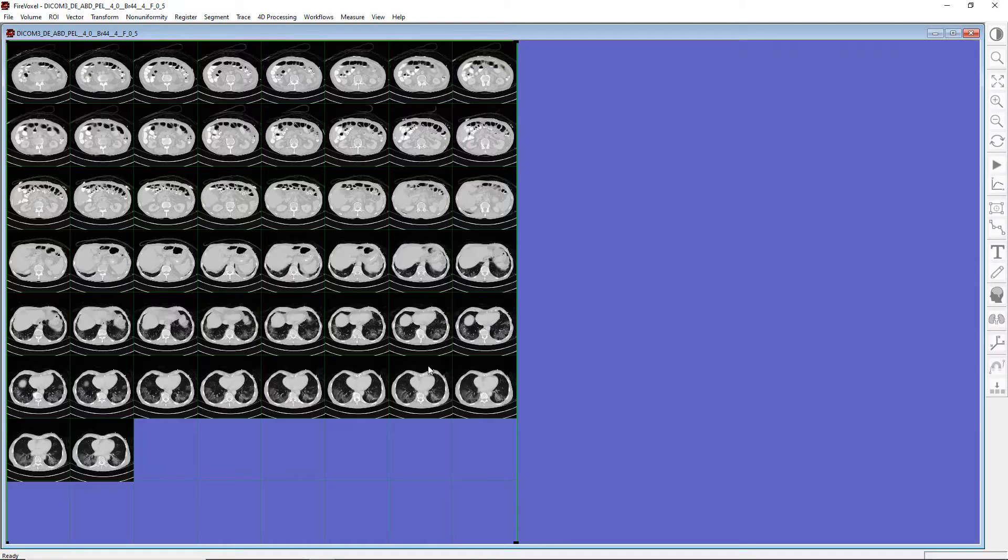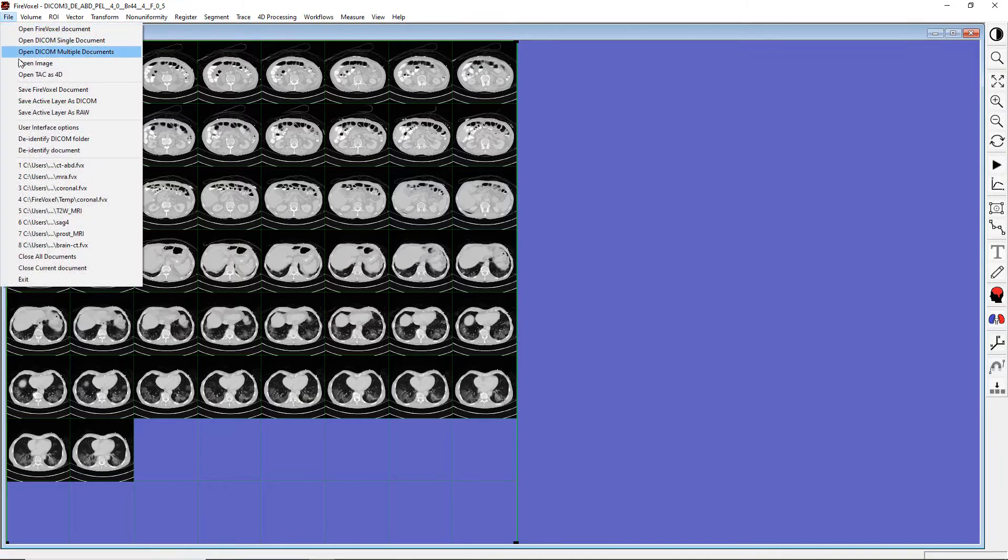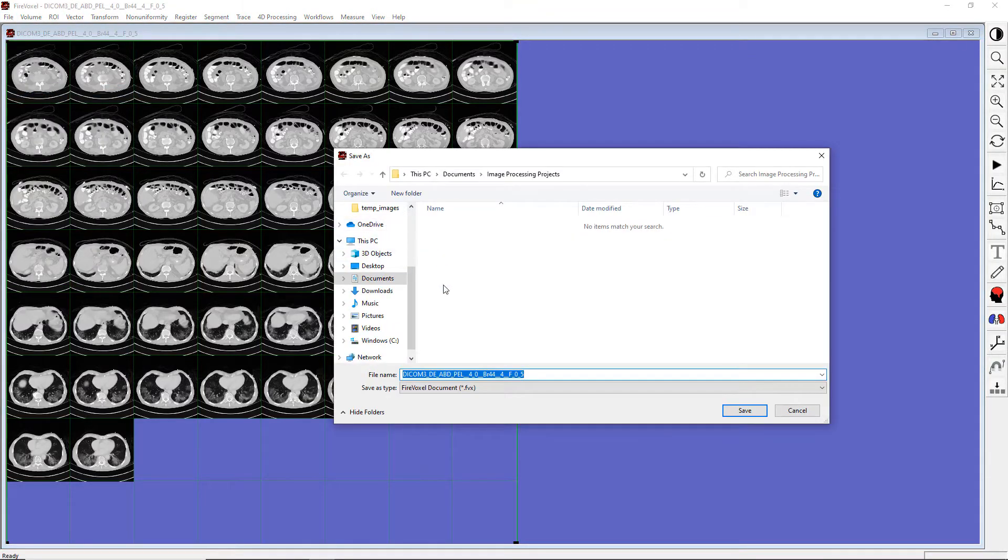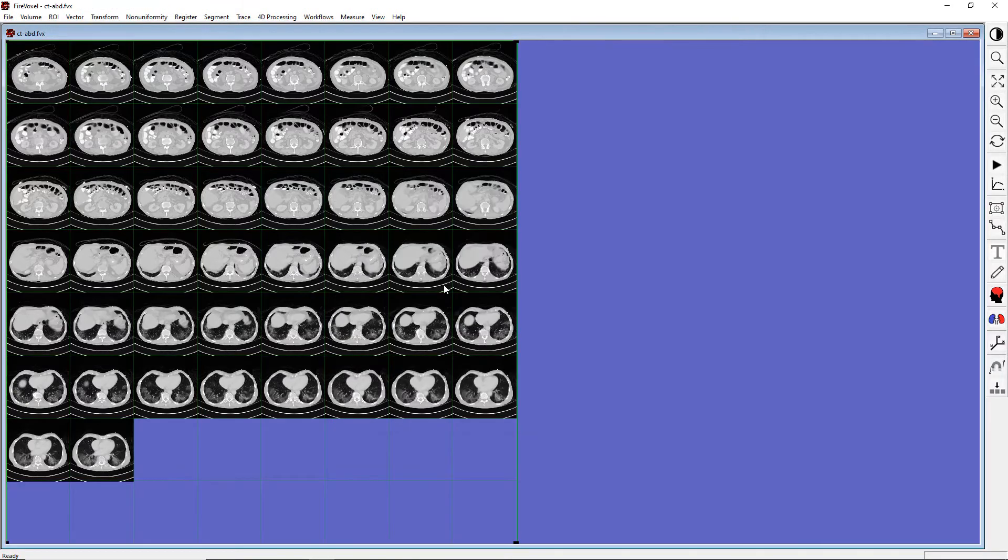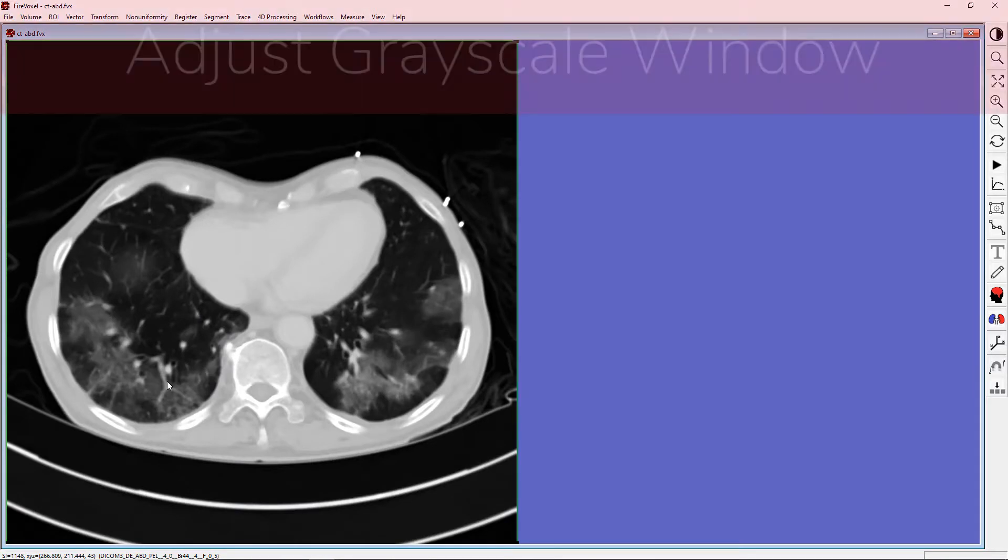And here are our abdominal images. Let's save them as a FireVoxel document. Now, let's select a slice through the lungs and double right-click to view it.